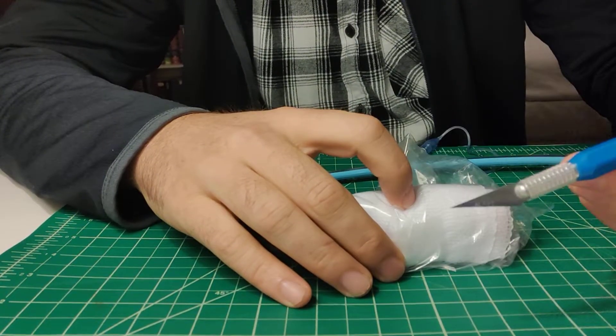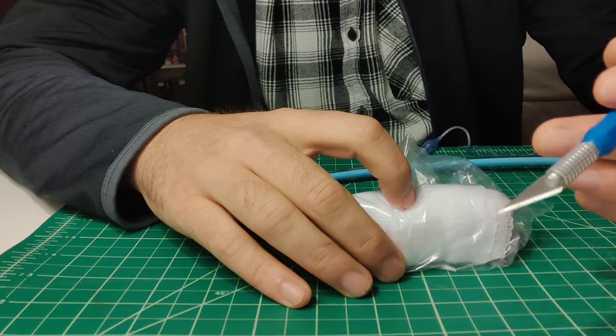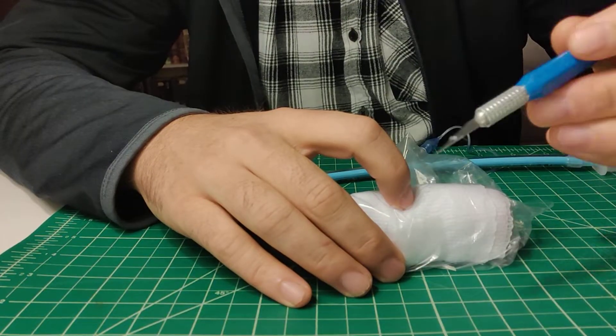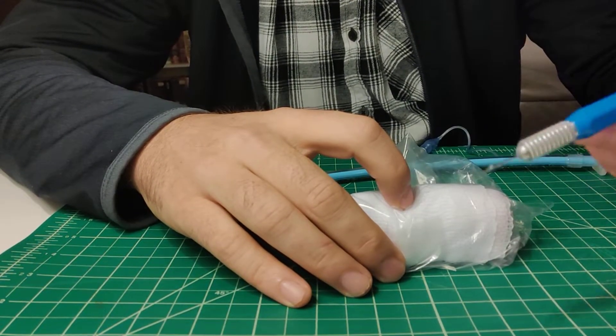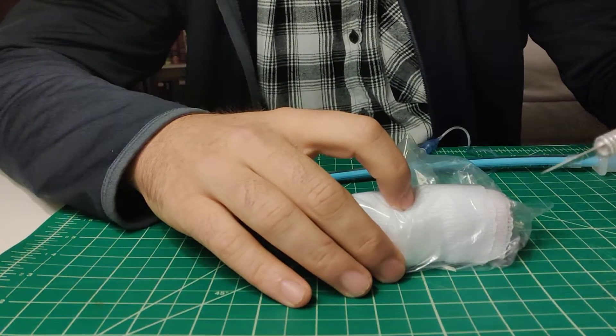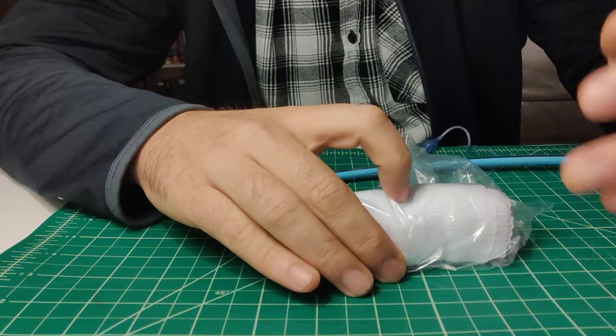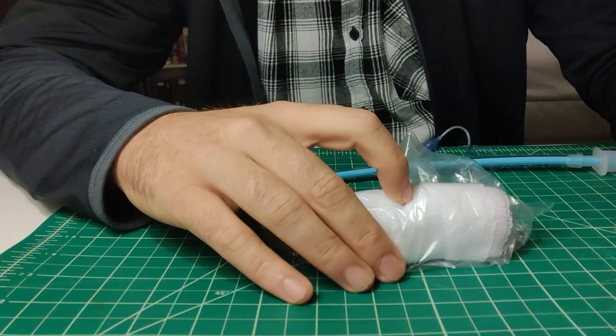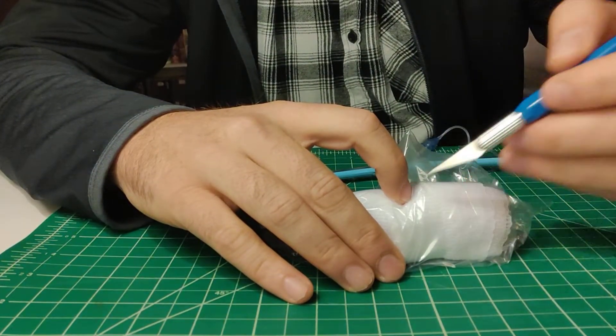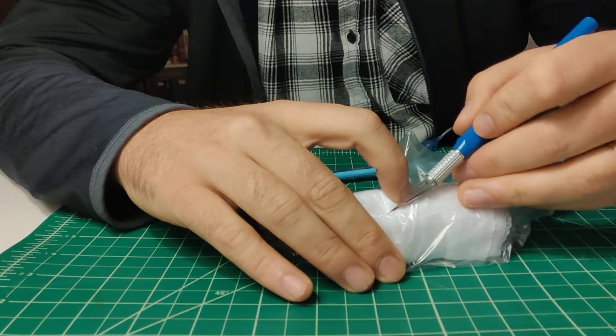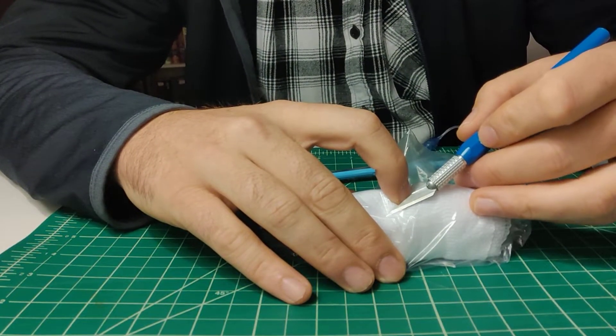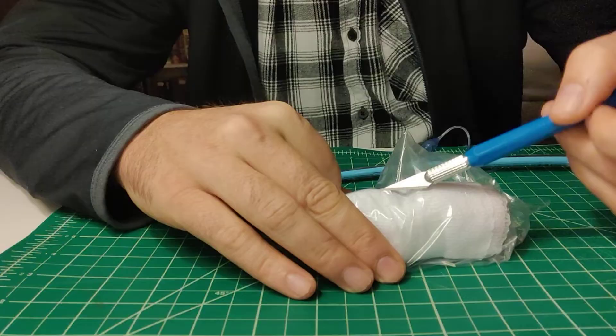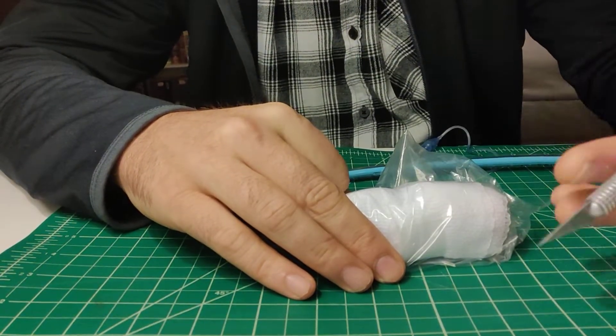Then you take your scalpel and what you're going to want to do is do, I'd say at least a two inch incision. If you can't really feel the anatomy, make your incision much longer. I've seen some sources say you can even start at the sternal notch and cut a really big one open if it's that desperate of a situation. As long as you stay midline, there's very little of hyper important structures to hit. So you're pretty safe doing that. So one of the things is with my first one was I cut myself when I was going in because I had my blade and my finger in the field at the same time, which is how they used to teach it. But I've noticed a lot of people, including Scott Weingard from EM crit now advocating that you remove your finger whenever the blade's on the field. And that's how I've been practicing it. So it was nice to see some validation there.